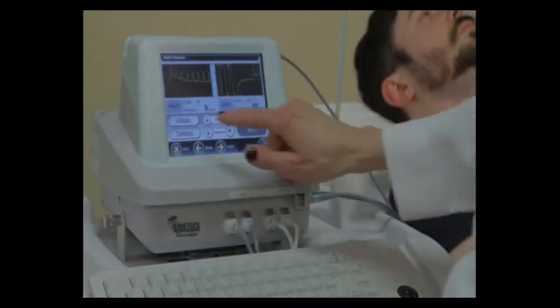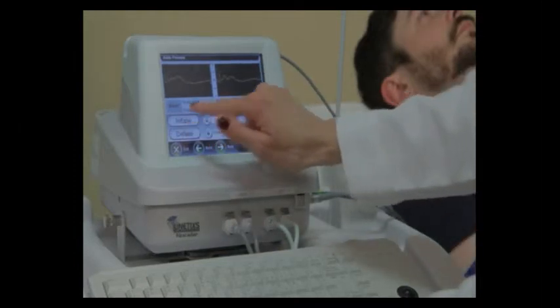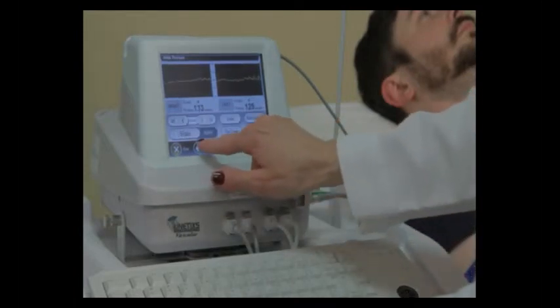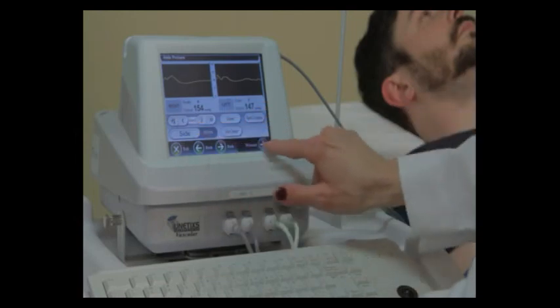Again we can see the waveforms coming across the screen, so she's going to press the inflate button, and this will automatically inflate the cuffs at the ankle. Now that we see a flatline, she's going to press the deflate button and wait for the return of pulses. We're going to scroll them back to the blue bar at the right of each screen, and our study is finished.